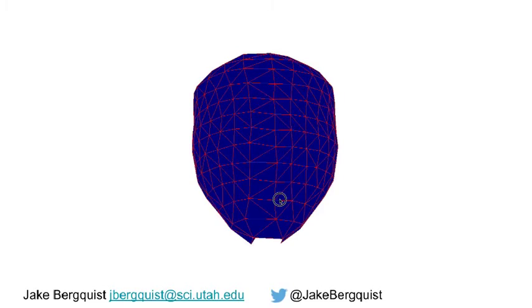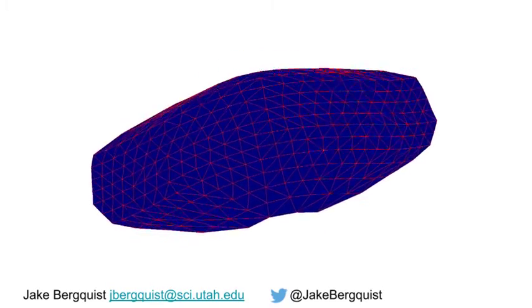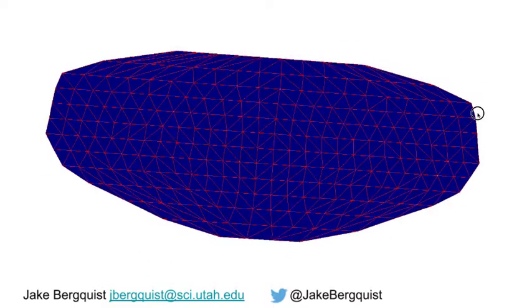We then assessed the reconstruction of pericardiac cage potentials from the recorded body surface potentials using a variety of metrics. Before we look at just a bunch of charts and numbers, though, let's have a look at the signals themselves. First, in order to see what's going on better, we're going to take our pericardiac cage, cut it along one edge, and flatten it so we can see all of the electrodes at once.